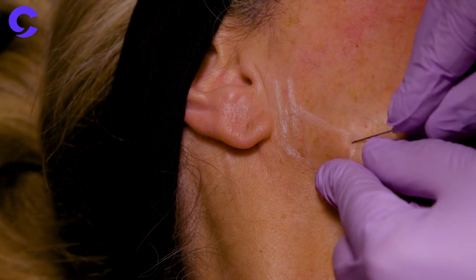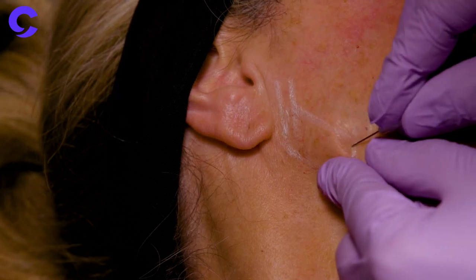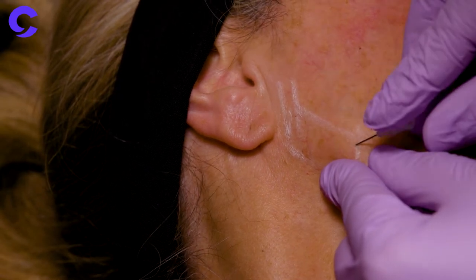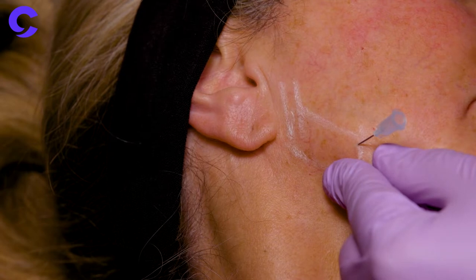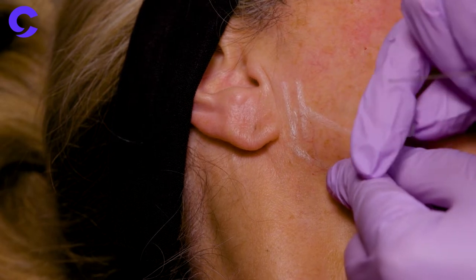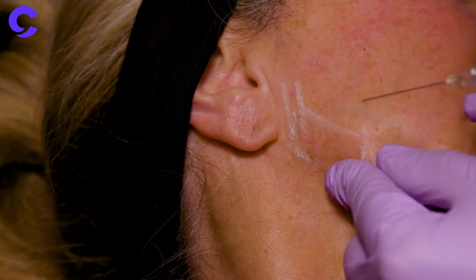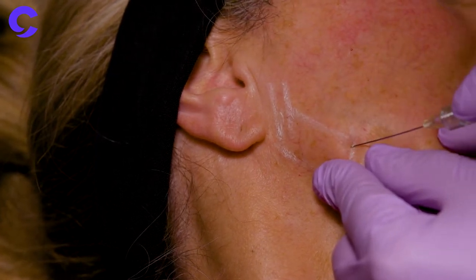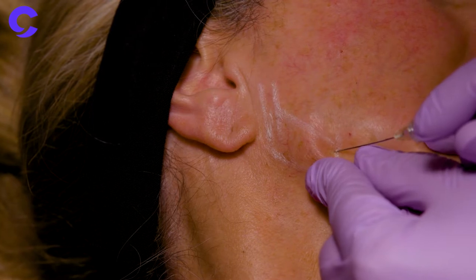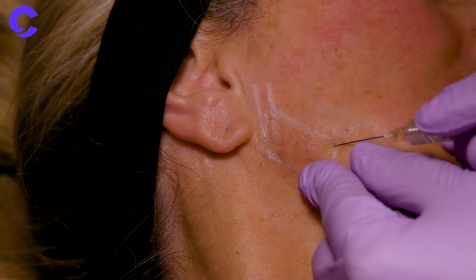We will now treat the jawline because this will influence the posterior vector of lift. Remember, this is in the region of the facial artery, so it's vital that we remain superficial.